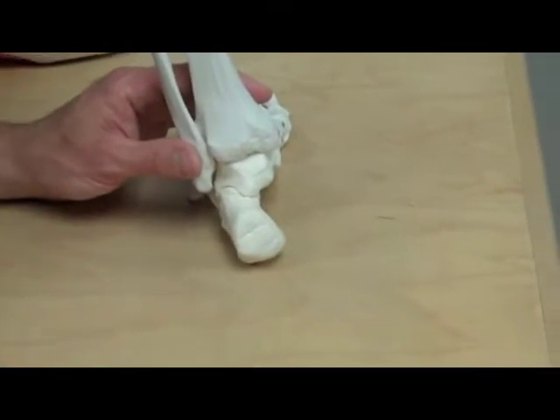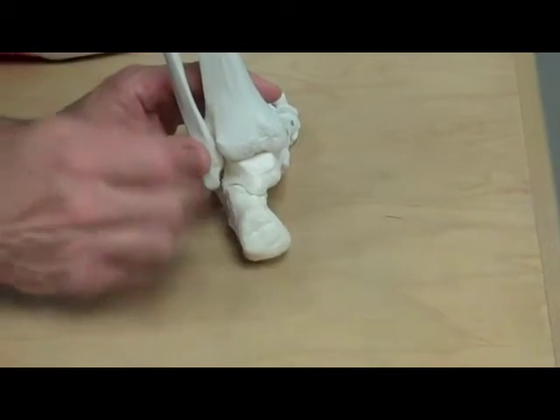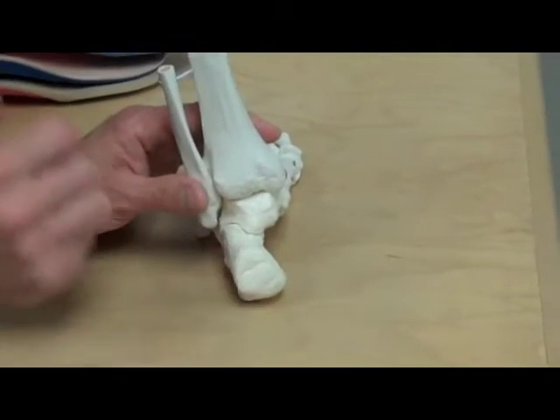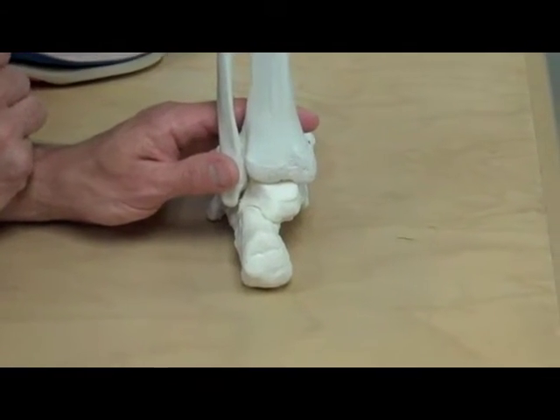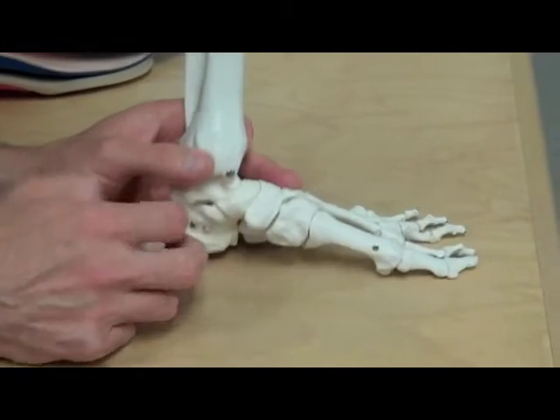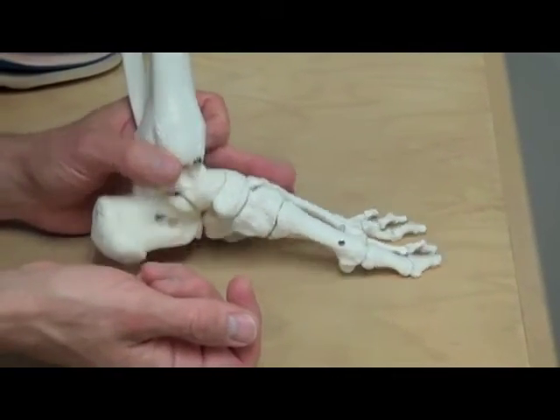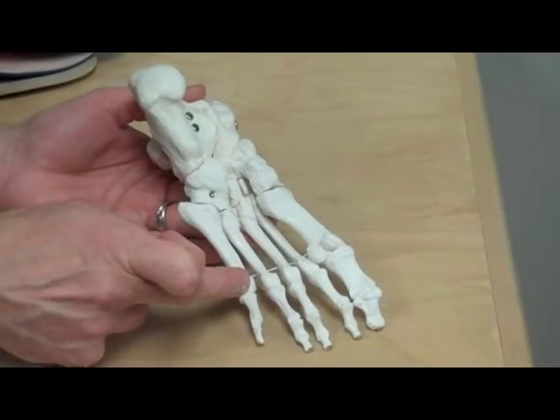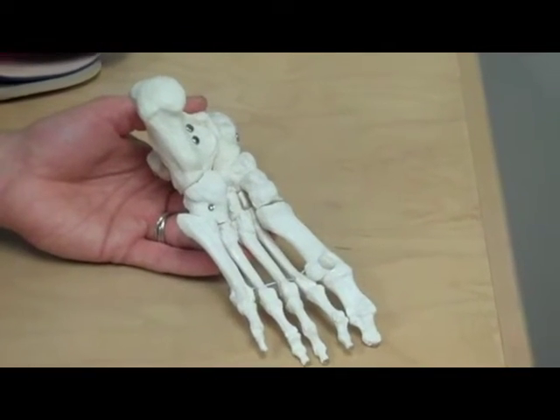The research is a little bit vague, not too specific, whether this actually does do a lot for the fascia or whether it doesn't. But in a lot of cases we attempt it and it does well for people. Some people do just a neutral heel where it's nice and flat, and we get just as good a result. Okay, what research does tell us, and this is counterintuitive to some things that some podiatrists do and some therapists do, is that we post the orthotic, meaning we keep the orthotic thicker on the outside, and then we skive it and wean it down so it's thinner towards the big toe.